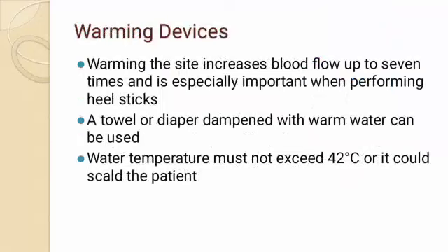Warming devices. Warming the site increases blood flow up to 7 times and is especially important when performing heel sticks. A towel or diaper dampened with warm water can be used. Water temperature must not exceed 42 degrees or it could scald the patient.